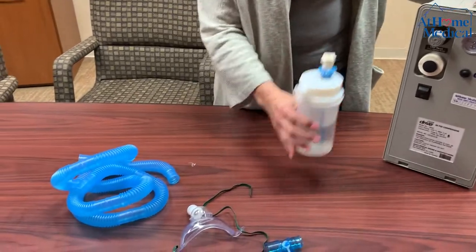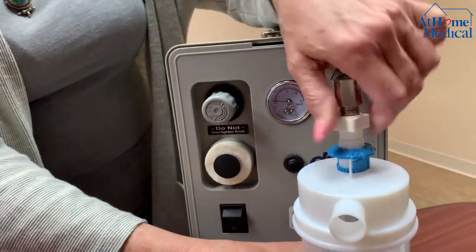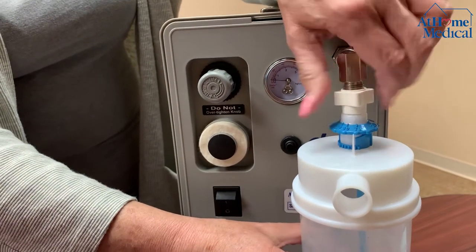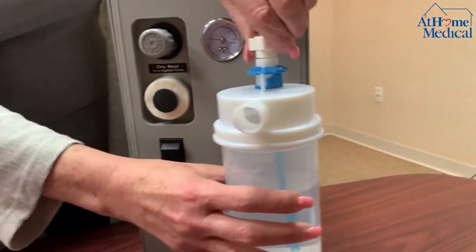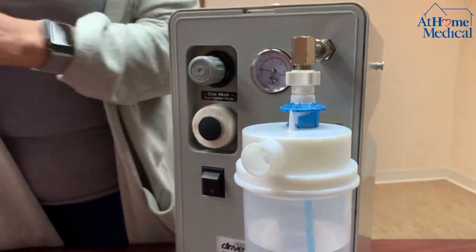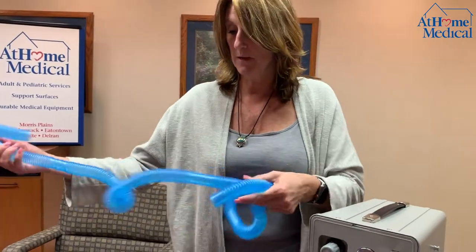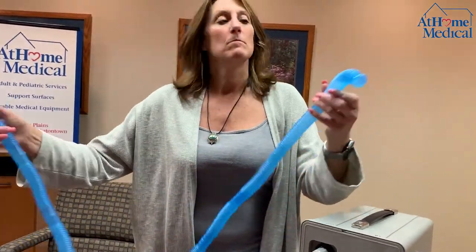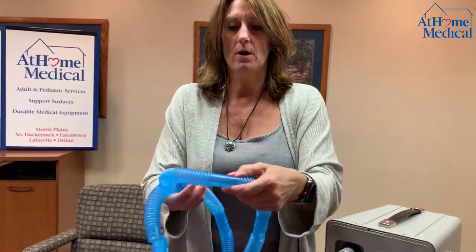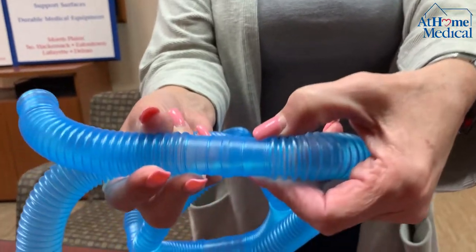You're going to start by taking the large nebulizer bottle and placing it onto the machine. Then you'll get tubing — it comes in 100-foot lengths — and you're going to cut it. When you cut it, you cut it in the middle of the two pieces that you see here.